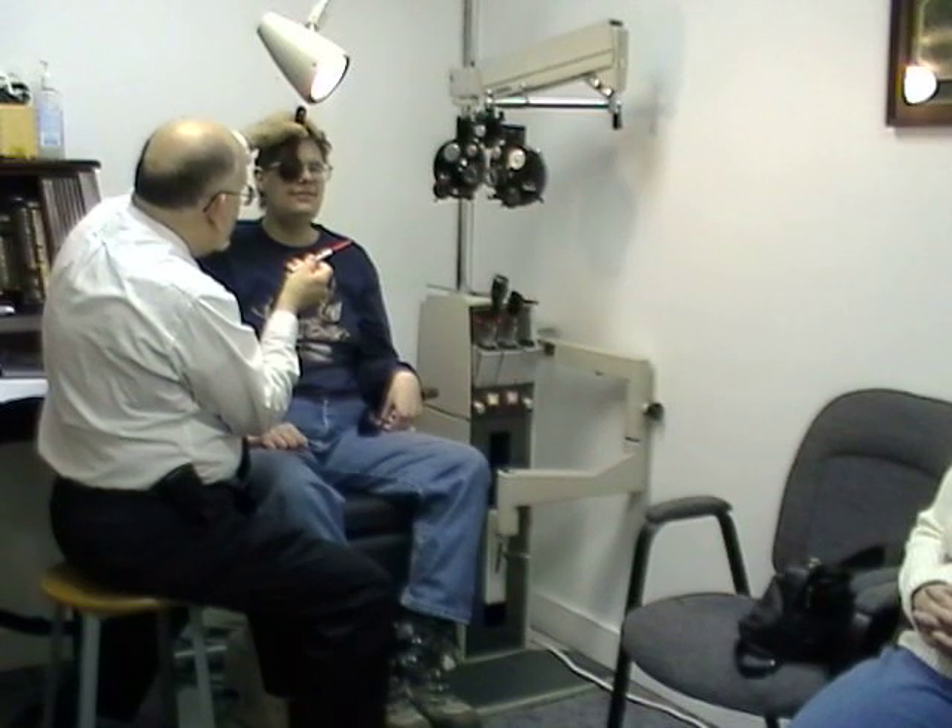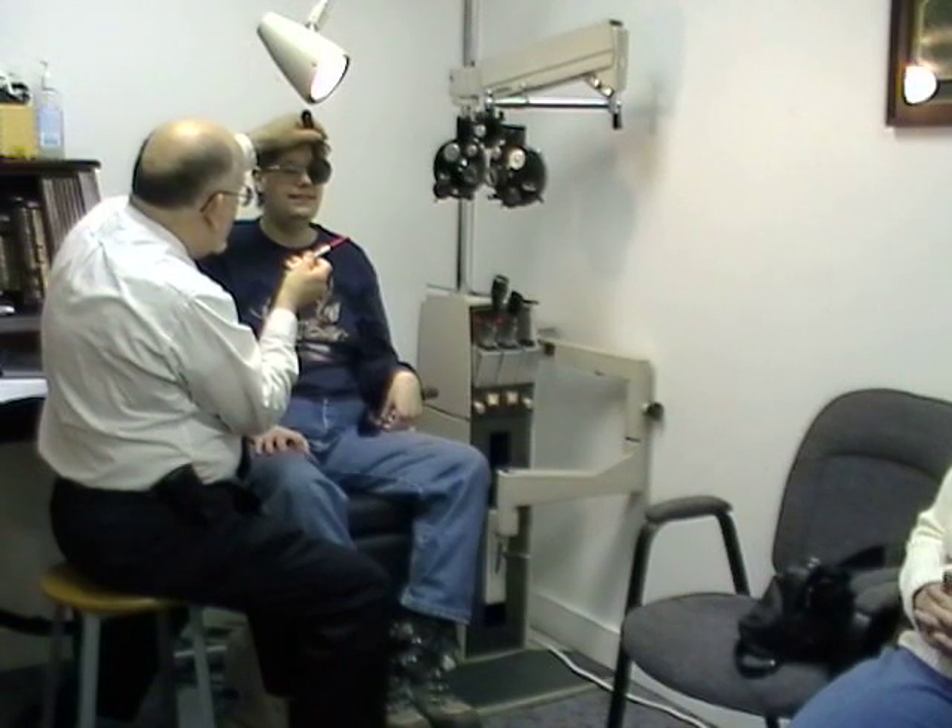What color does it look to you? It's almost completely black. Completely black? Yeah. That's an unusual condition — we're noticing protanomaly. Protans do not perceive color at all in the red range.